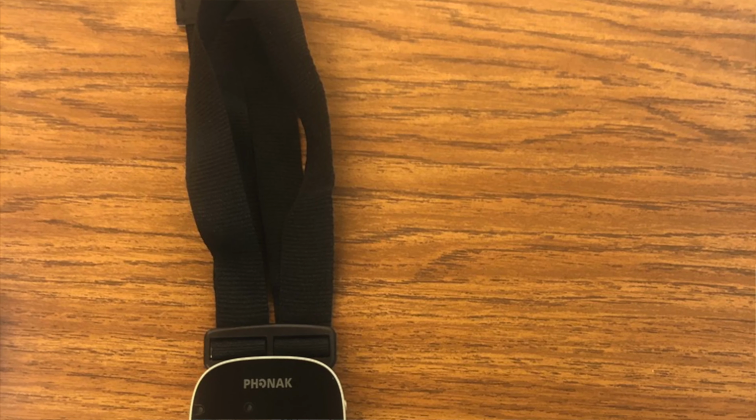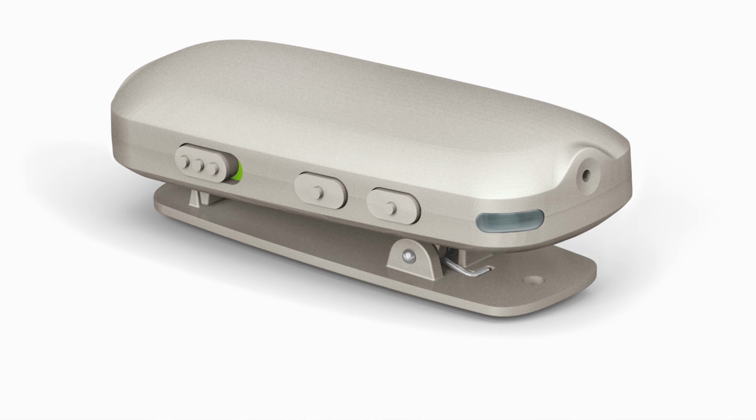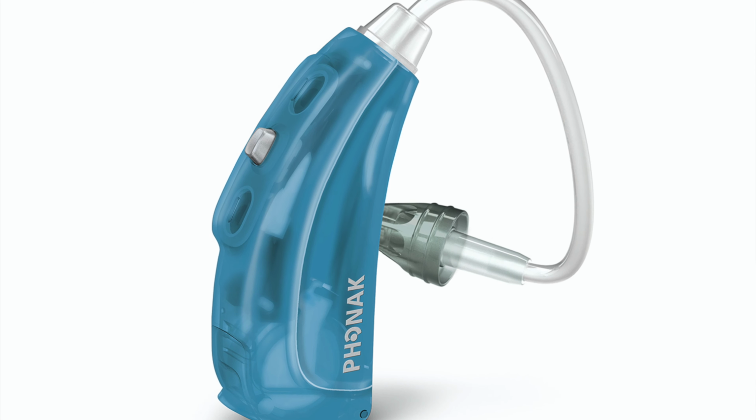What is a remote microphone hearing assistance system? You might have heard of them as an FM system or a DM system, but simply put, it's a system that uses a microphone placed near or attached to a sound source, like a teacher's mouth or a computer, that can then be transmitted wirelessly to various receivers. The receivers can be attached to the student's hearing aids or can be hearing aid-like devices or even speaker systems in the room. This allows the speaker's voice to be heard and understood more easily.